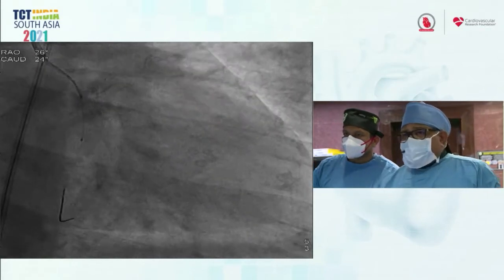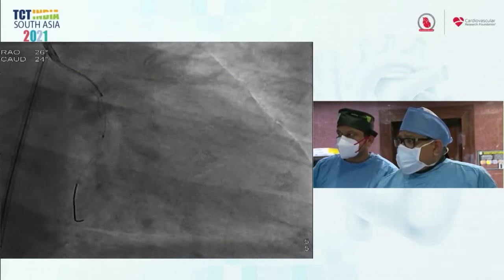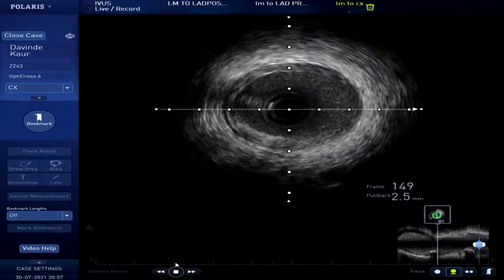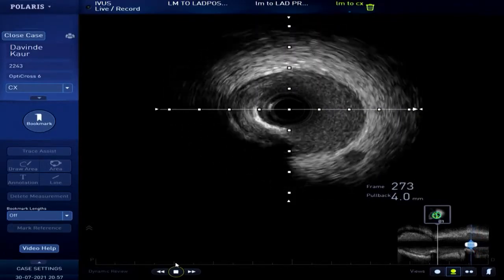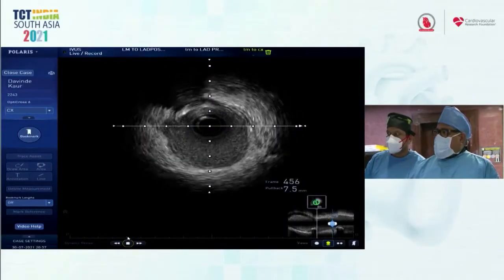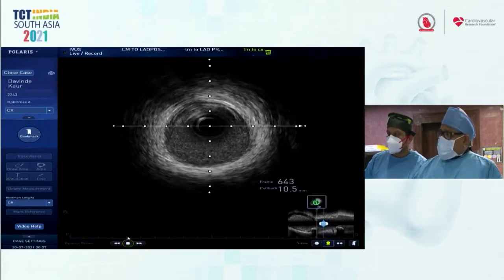So let's go ahead. This is the IVUS across the left circumflex. Can you run the IVUS of the left circumflex? I would like the audience to note that he's actually got his guiding out and a wire in the sinus, because he wants to image the ostia. I think that's an important aspect, right, Rajesh? Absolutely right. So this is what Gary was saying. Here is the ostia across the LCX. You see it's disease free.